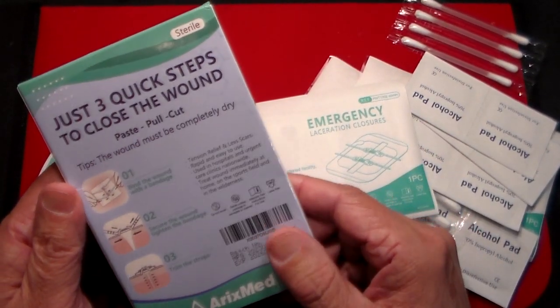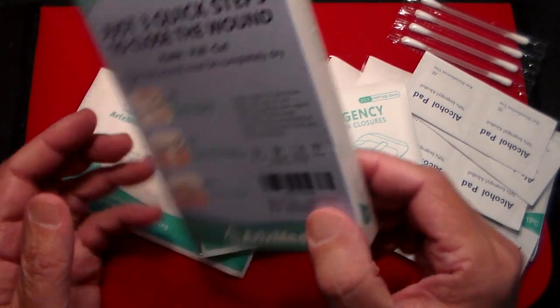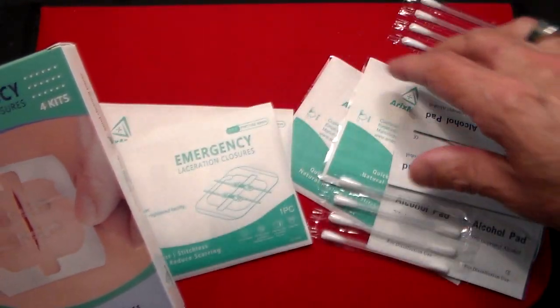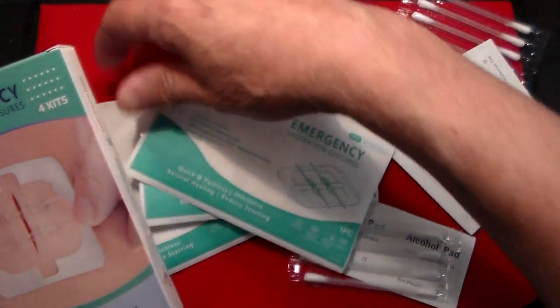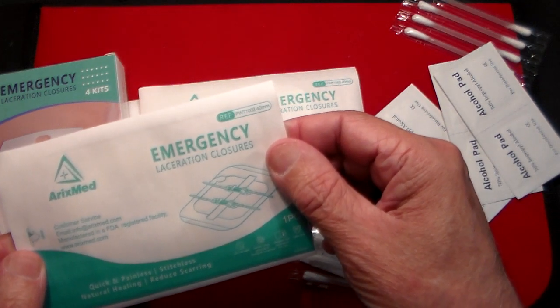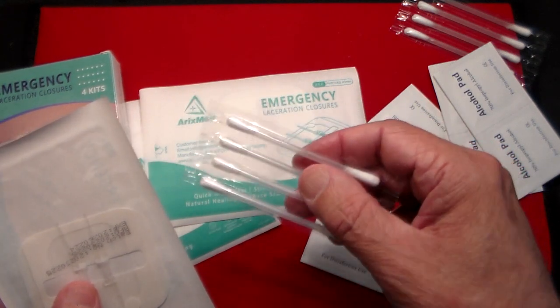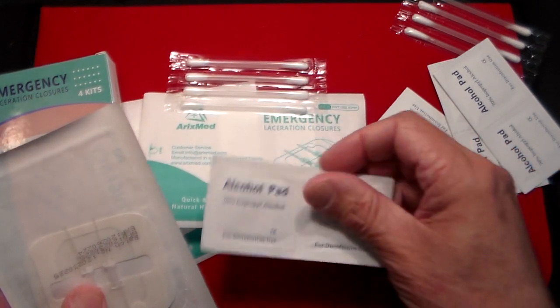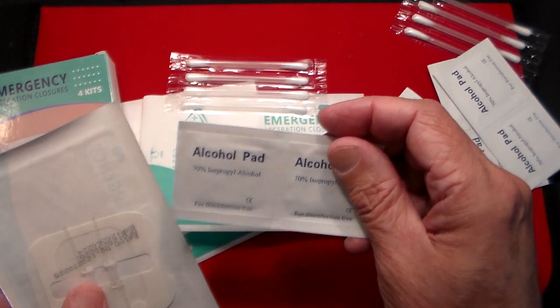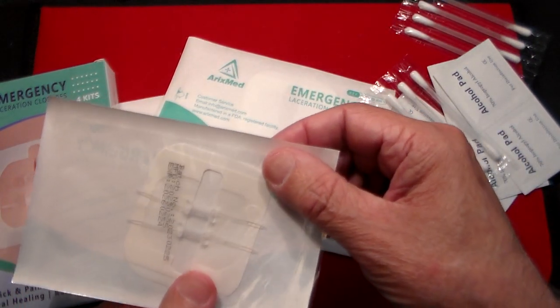This is something that just caught my eye on Amazon, and I'll show you how this works. I've never tried it, but I thought I should have some. Having little ones around the house lately, it's something I thought I should have. So the way this works, basically, is you get four of these different closure devices. They've put in a bunch of Q-tips so you could apply a little antibiotic ointment if you want to. They've also got a bunch of alcohol pads, so the first thing you would do is wipe a cut down with an alcohol pad.